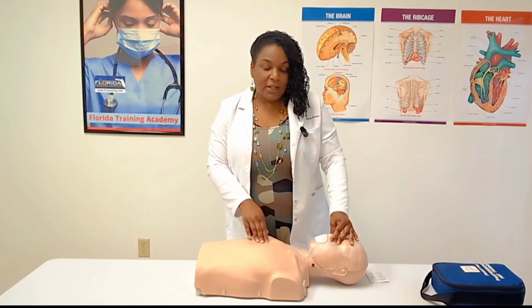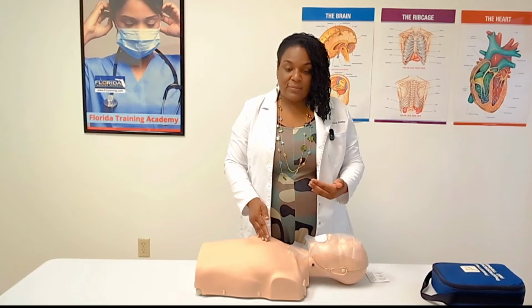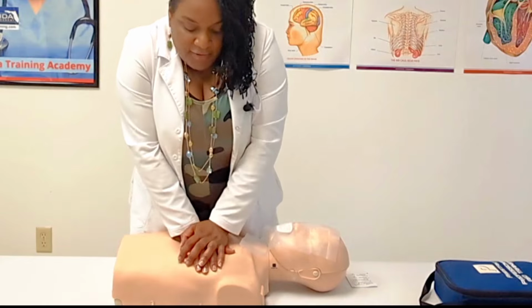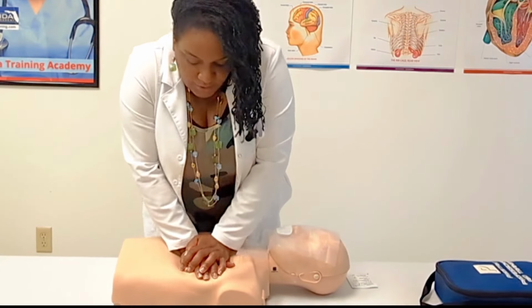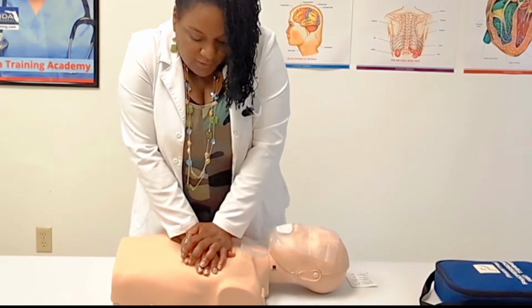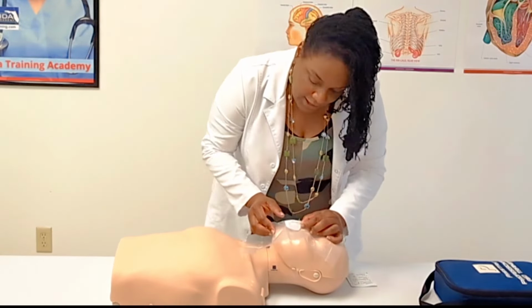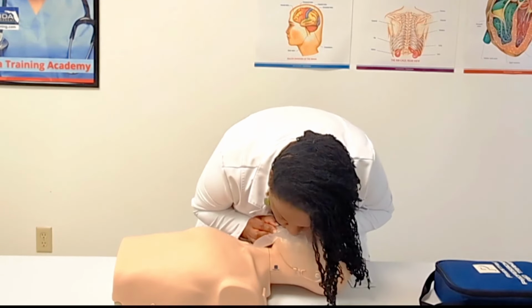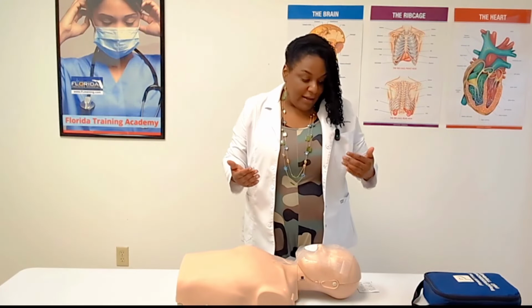Each breath should take no longer than 1 second, and you have 10 seconds total before you have to resume your chest compressions. So let's practice again. 1, 2, 3, 4, 5, 6, 7, 8, 9, 10, 11, 12, 13, 14, 15, 16, 17, 18, 19, 20, 21, 22, 23, 24, 25, 26, 27, 28, 29, 30, followed by 2 breaths. And you keep doing that until help arrives.